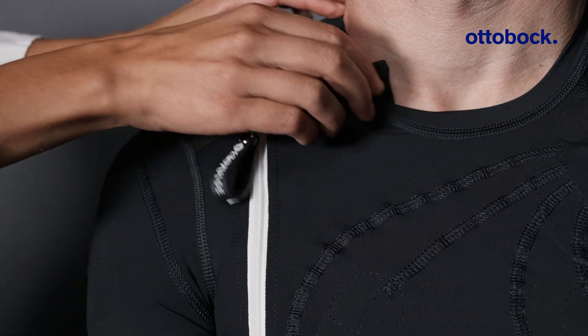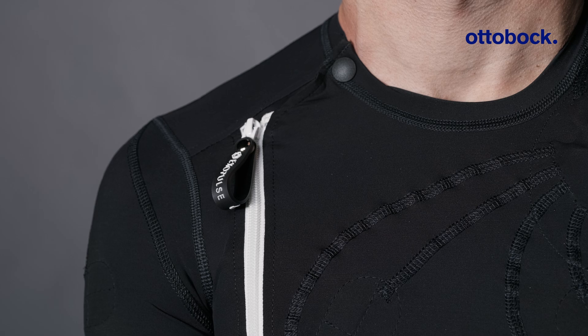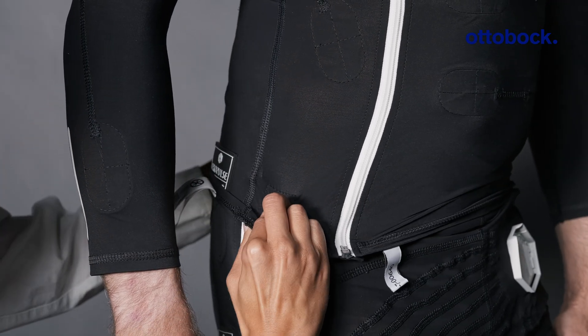When putting on the jacket, make sure to close the zipper and the secure button. Attach the jacket with the pants using the six garment attach buttons.